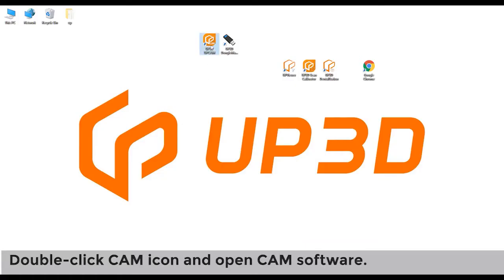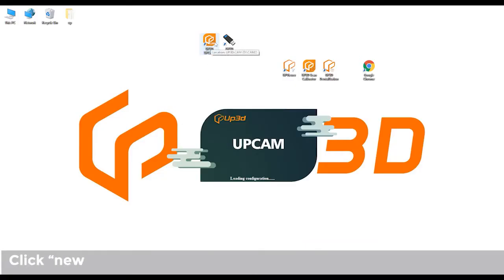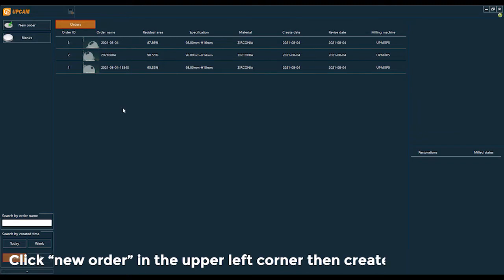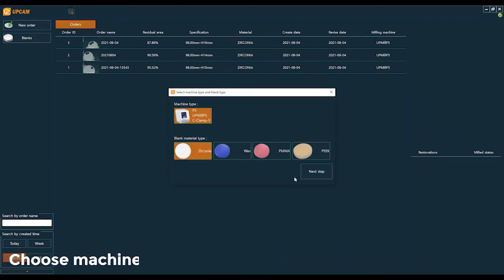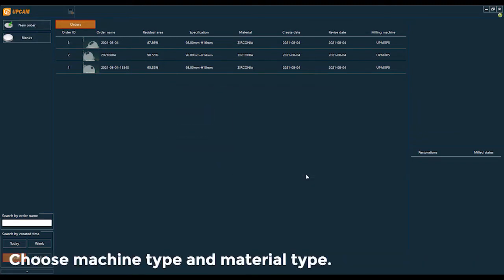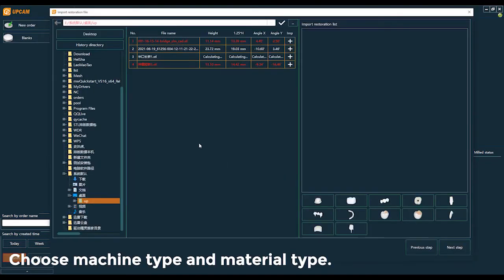Double-click CAM icon and open CAM software. Click new order in the upper left corner to create a new order. Choose machine type and material type.